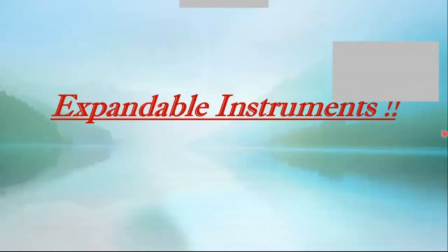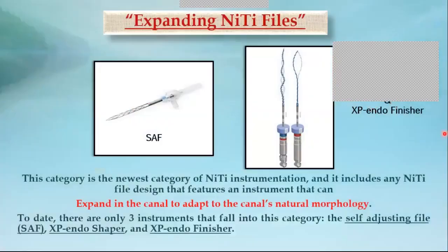And then is the new category of root canal instrumentation systems, the expanding nickel titanium instruments. This category includes any file design that has the ability to expand in the canal and adapt to the canal's natural morphology. Today, there are only 3 instruments that fall in this category: the self-adjusting file with the SAF technology, the XP Endo Shaper, and the XP Endo Finisher with the Max Wire technology. Let's know a bit about them, their mechanism, and how they work.